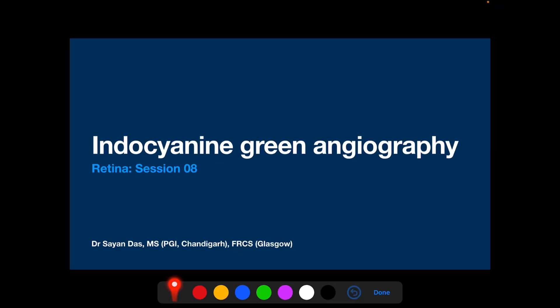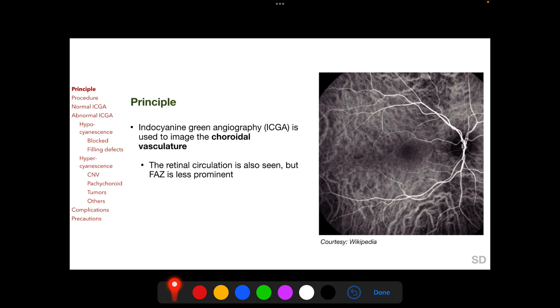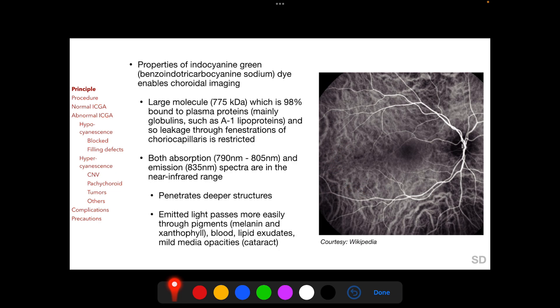Welcome. In this session we will be discussing indocyanine green angiography. Indocyanine green angiography, or ICGA, is used to image the choroidal vasculature, as we see here in this ICGA. Properties of indocyanine green, or ICG, enable choroidal imaging.